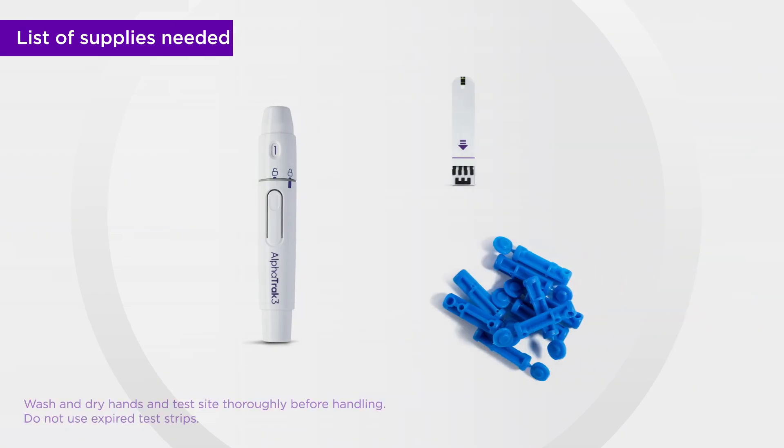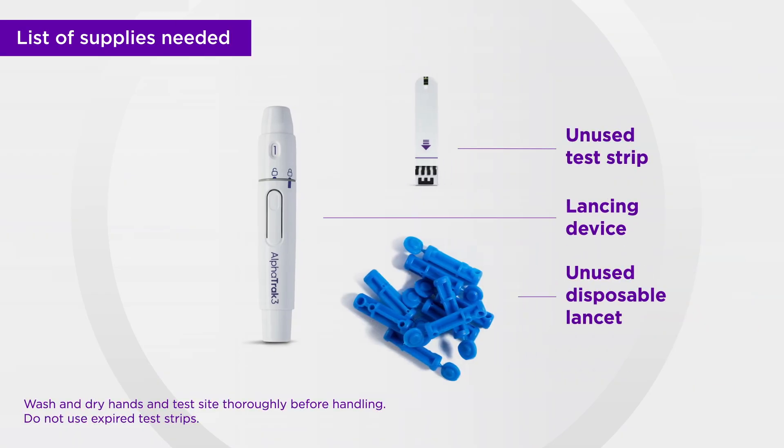After preparing the sampling site, you can begin using your meter. Before handling the test strip and testing site, we recommend washing your hands and the testing site with soap and warm water and drying thoroughly.